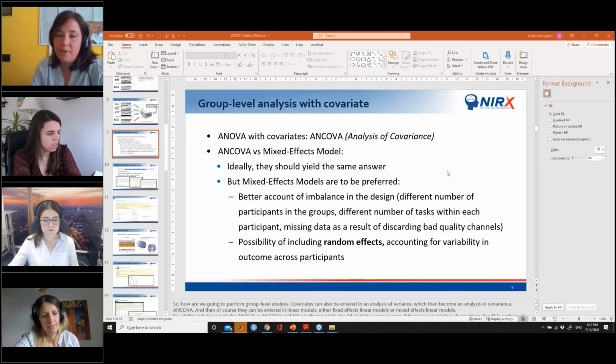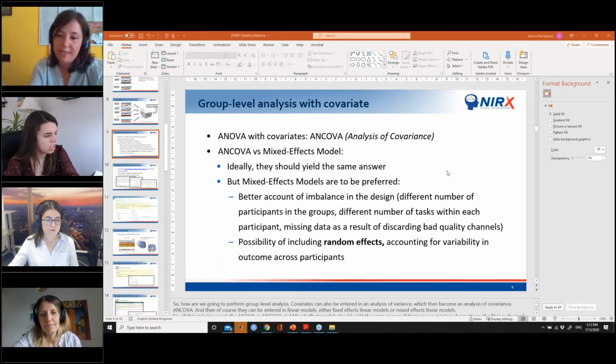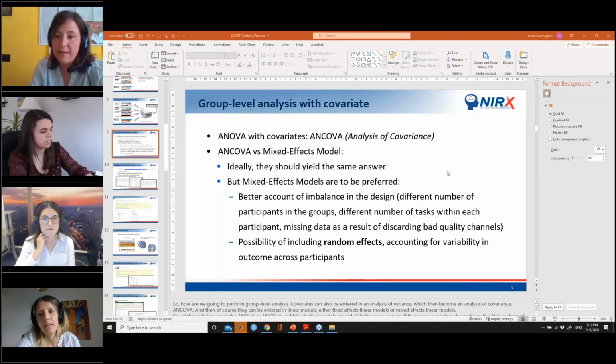Yes, exactly. The fact that they are calibrated in between means basically that it's a new set of calibration parameters, right? Exactly, yes. So the raw data will have different values.